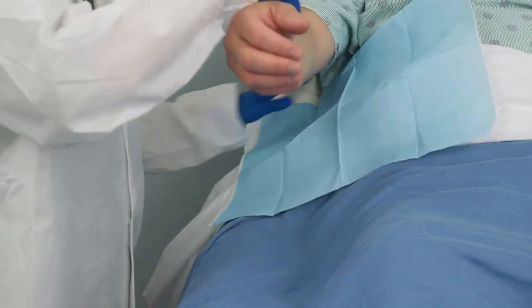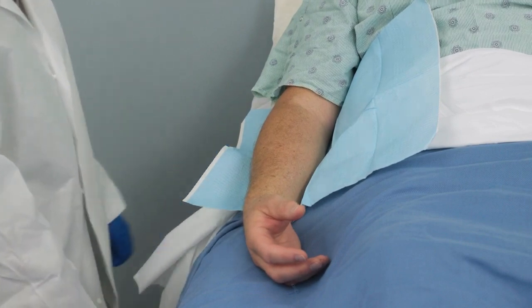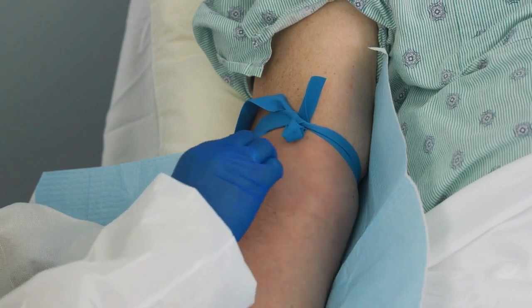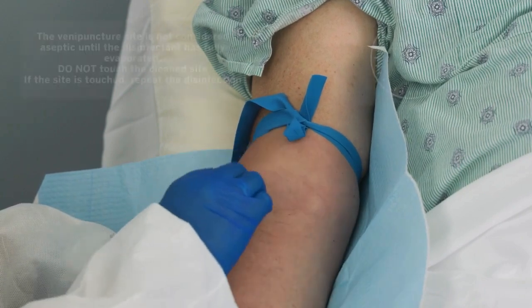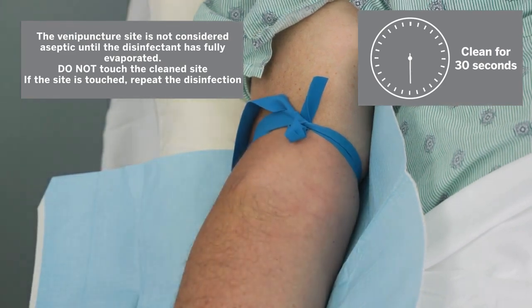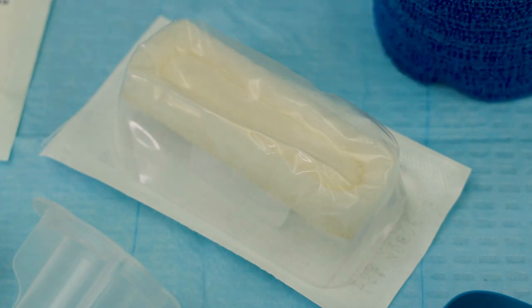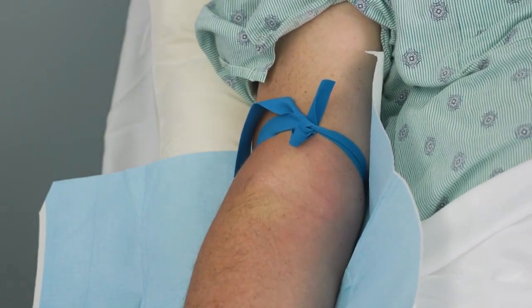The arm is the recommended site for drawing a blood culture. Place a disposable underpad under the patient's arm. Locate the vein and apply a disposable tourniquet, then palpate to locate the vein. Disinfect the chosen venipuncture site according to your facility's approved procedure. Recommendations are to cleanse the site with friction for 30 seconds using 70% isopropyl alcohol. Allow to dry, then apply the second disinfectant following the manufacturer's recommendation. The venipuncture site is not considered aseptic until the disinfectant has fully evaporated.